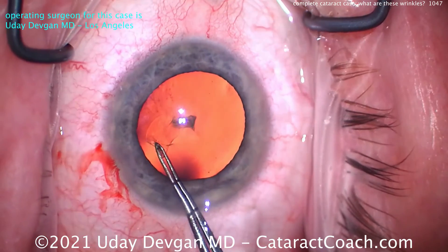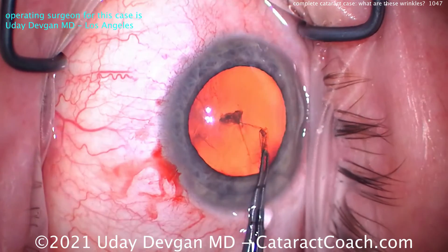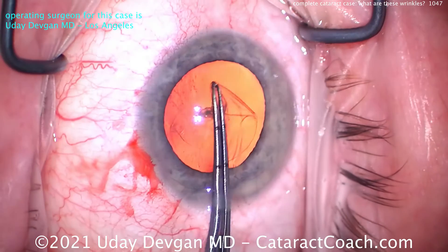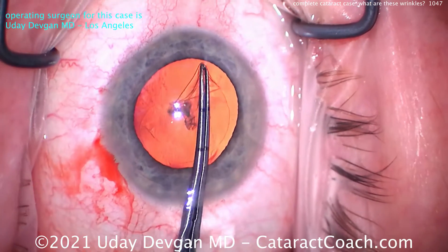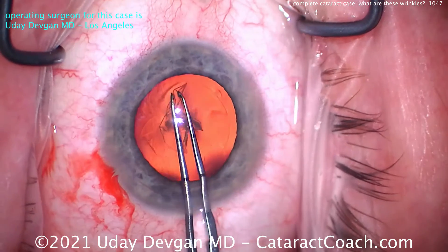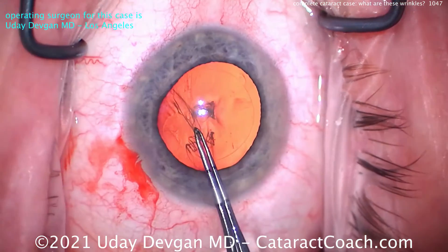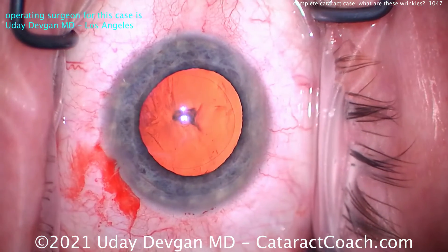I don't think there's really much zonular support issues here; I think the zonules are fine. And you can see as we tear the rhexis, there are no more wrinkles. I think those wrinkles were just from when we were poking in with the forcep tips. These tips in the forcep are not needle-sharp, so it does take a little bit of effort to poke in. That rhexis is complete and looks pretty good — just about five millimeters diameter.